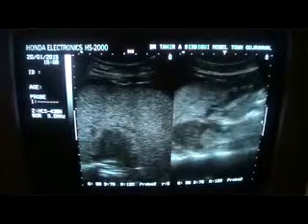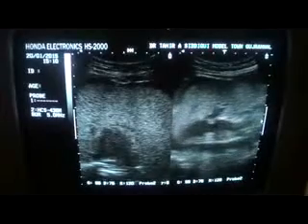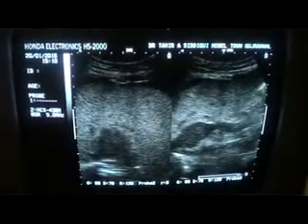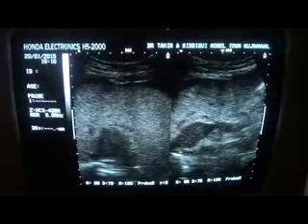Let's have a longitudinal section. Let's see where the caudate lobe is — do we see the caudate lobe? This is in fact the location of the caudate lobe. This is the longitudinal section of the left lobe of the liver. This is the caudate lobe, and this is the IVC.